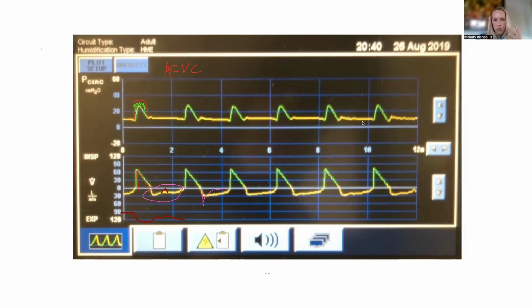So they're pulling extra in inspiration, and from what I see, they are also applying expiratory muscles and pushing extra hard during expiration. This patient is working on inspiration and expiration. So they need more flow, more pressure, more support during the inspiratory phase. And I think if you offloaded that amount of pressure, that would definitely help overall with their work of breathing. So for this patient, most likely they are a little bit flow starved or support starved.